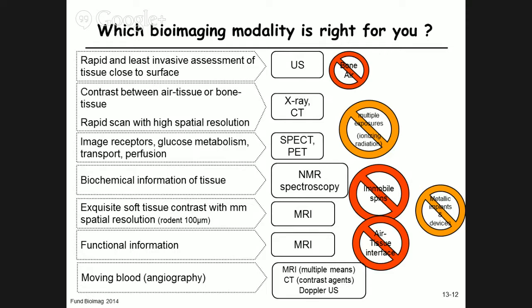Very often it depends. For the teeth, typically, it's okay. A screw in the bone usually is also okay. That really depends, but to think about here, it's stents from bypass operations in the heart or in the brain, pacemakers, insulin pumps, and so on.